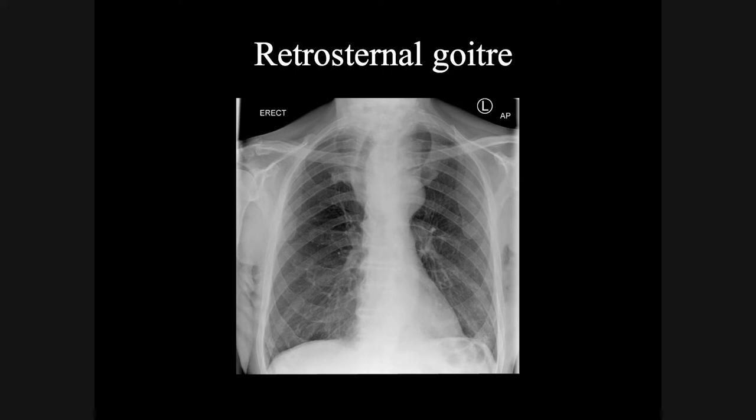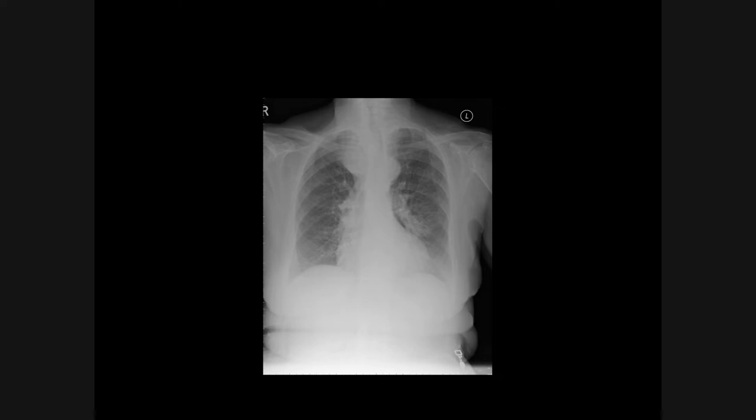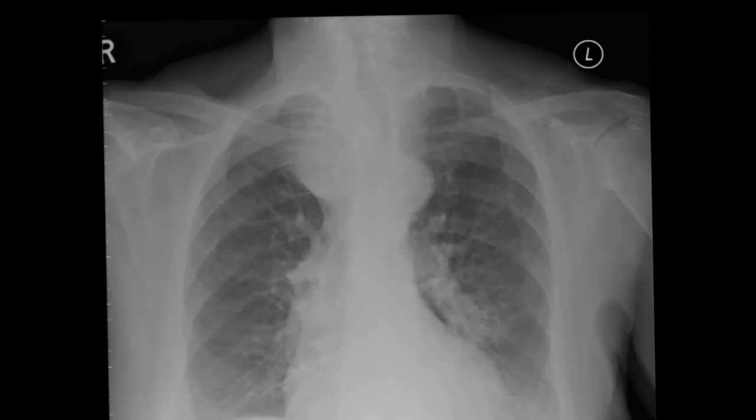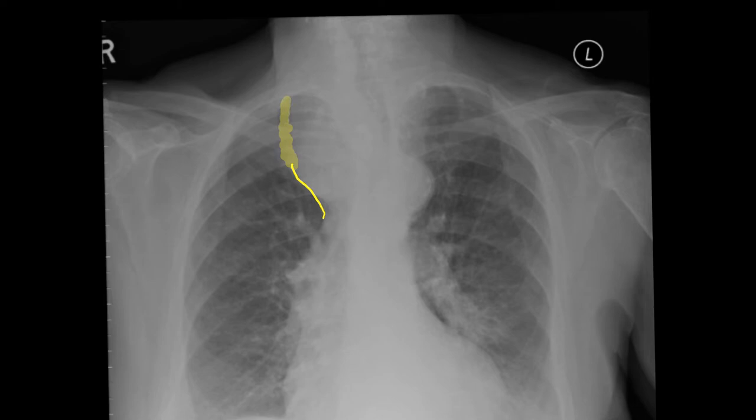This is another case of a retrosternal goiter. Once again you can see the sharp border that the goiter makes with the lung adjacent to the left hand side. The goiter actually fades before, at and above the clavicle. Note also the deviation of the trachea to the left hand side by the goiter.